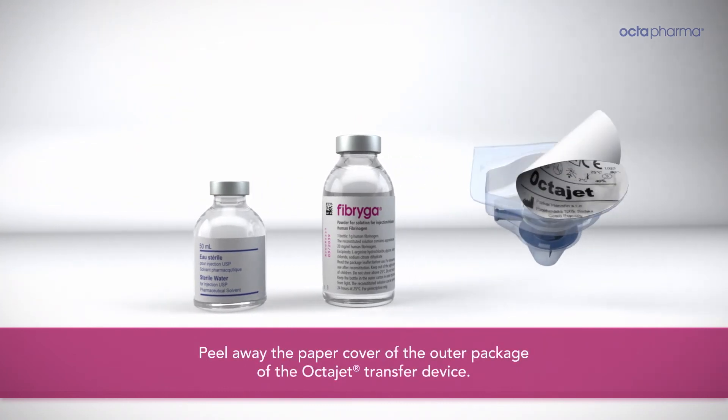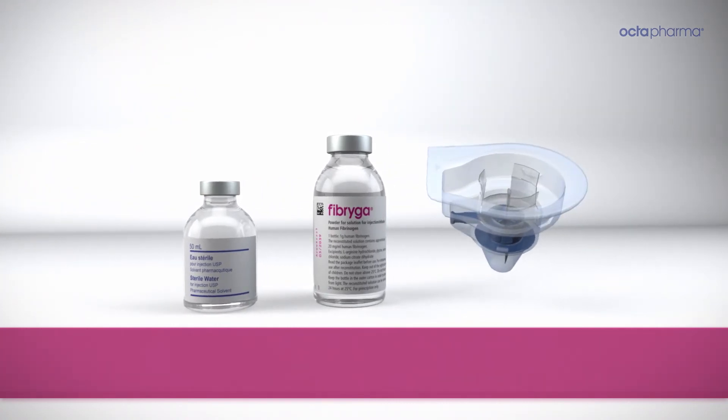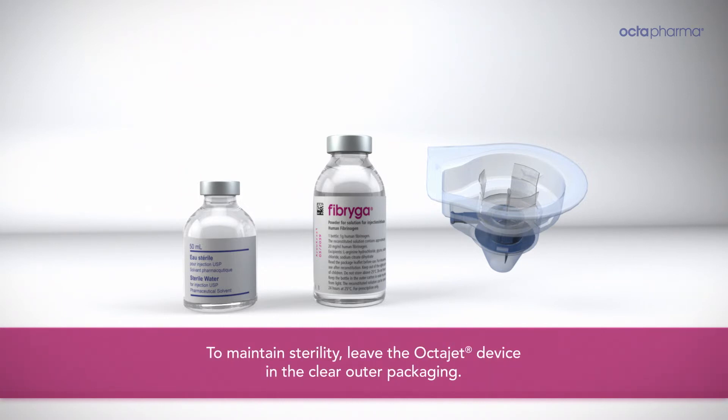Peel away the paper cover of the outer package of the OctoJet transfer device. To maintain sterility, leave the OctoJet device in the clear outer packaging.